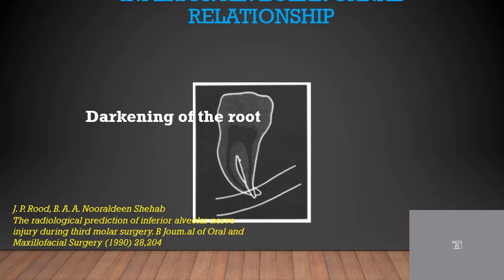So coming to the root criteria, it is given by Rood and Shehab. They gave some categories for radiological prediction of inferior alveolar nerve injury during third molar surgery.